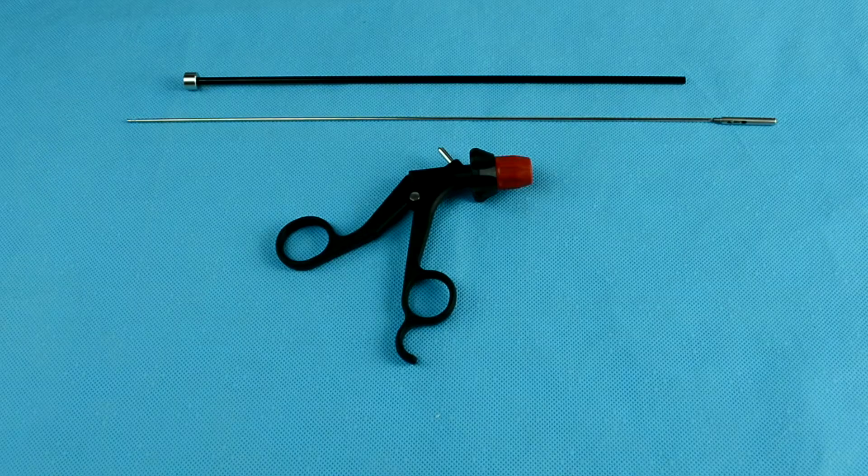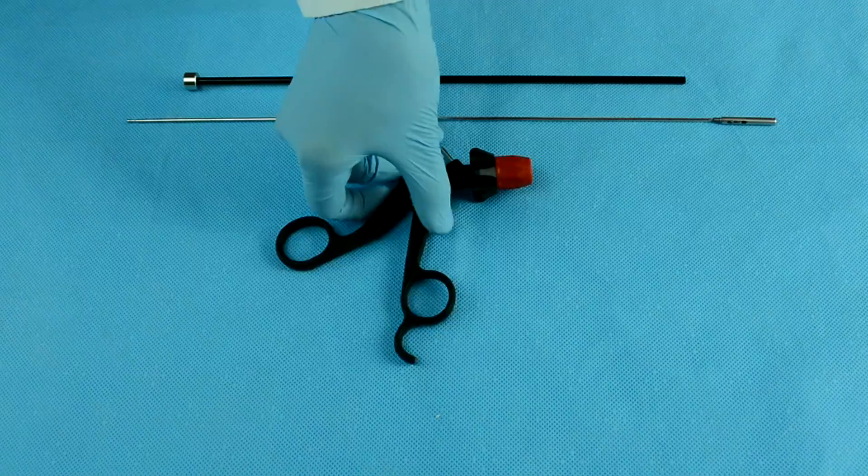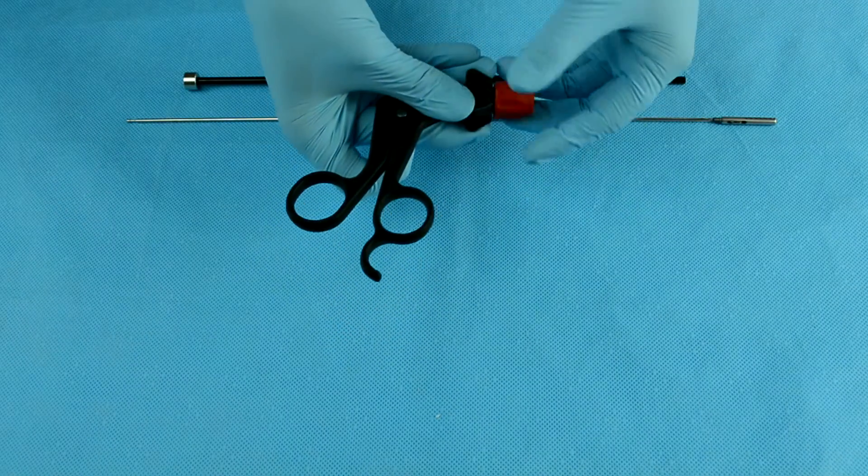AED's Precise Laparoscopic Instruments are comprised of three parts: an insulated shaft, a jaw insert, and a standard handle with a rotator cap that can be taken apart.